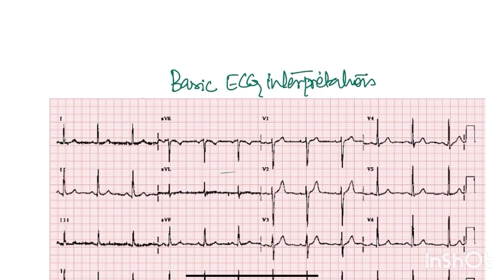So we all have faced cardiac patients in our practice, and they would usually come with their ECG report. And when we see that report, most of the time we are clueless what to tell this patient, whether to refer him or not. So having a basic understanding of ECG is important. It not only helps us understand the severity of the situation, but at the same time it develops patients' confidence in us.